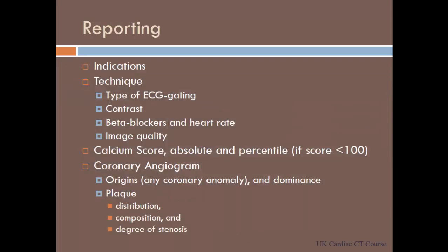So now, in terms of reporting, how to report cardiac CT angiography. So you start with, yes, Gabby.